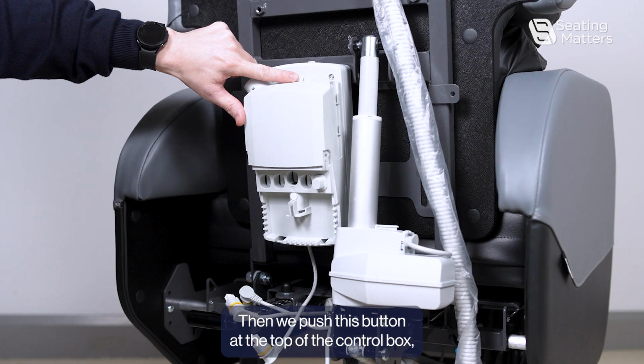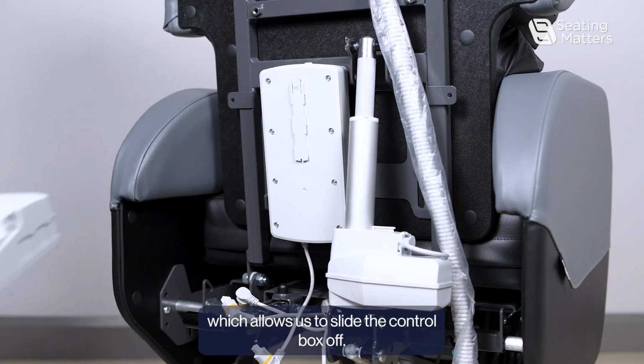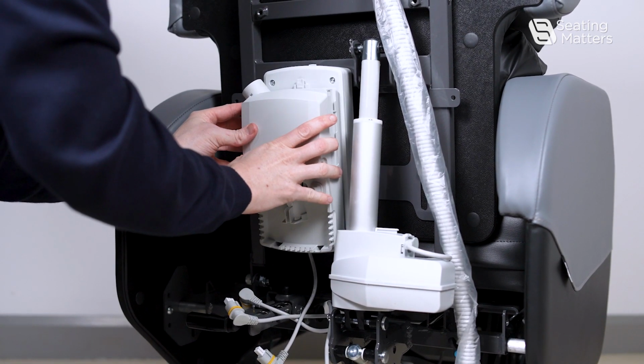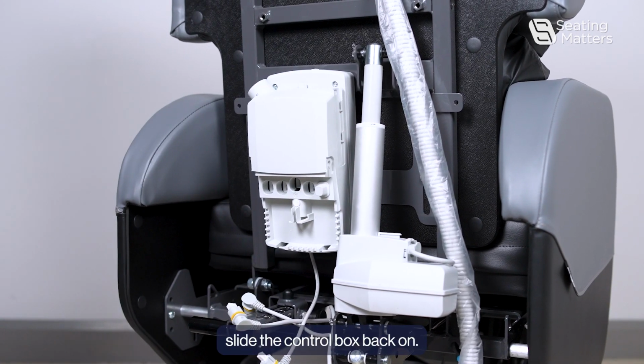Then we push this button at the top of the control box, which allows us to slide the control box off. We then slide the control box back on.